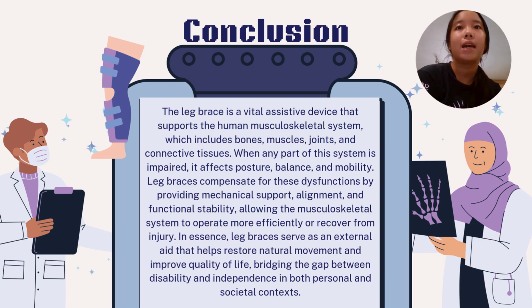In essence, leg braces serve as an external aid that helps restore natural movement and improve quality of life, bridging the gap between disability and independence in both personal and other daily life.